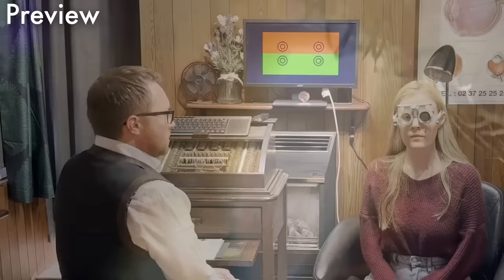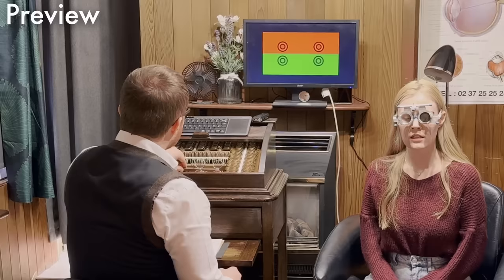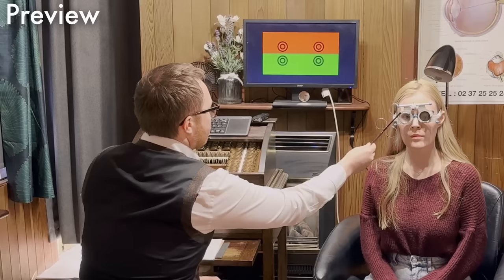So would you say it's better on the red, the green, or are they about the same? The red is a bit better, yeah. Okay. So if I were to pop this lens in front, is it a bit more on the red, a bit more on the green, or are they about the same? I think the green, actually, with this one.